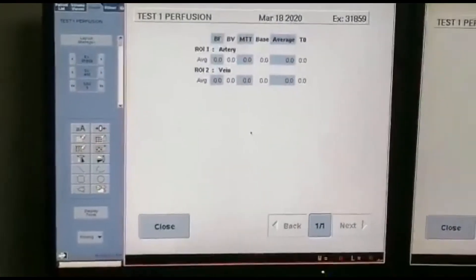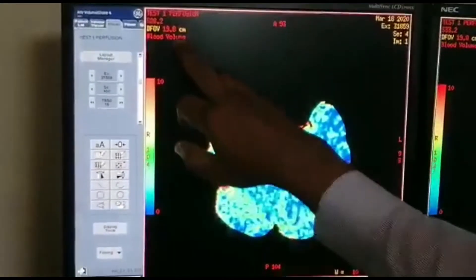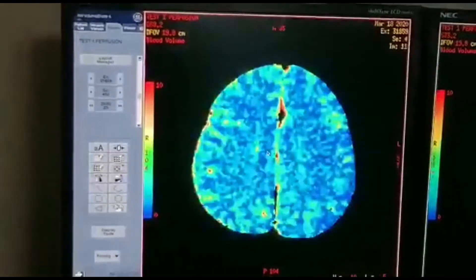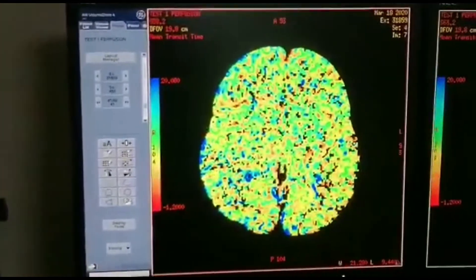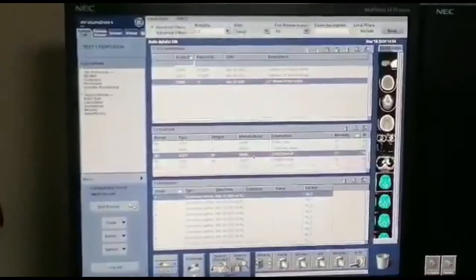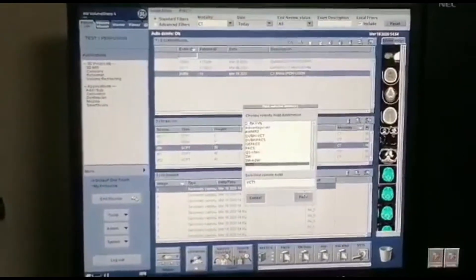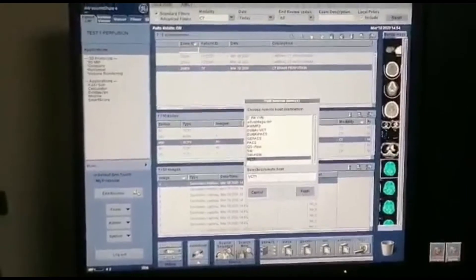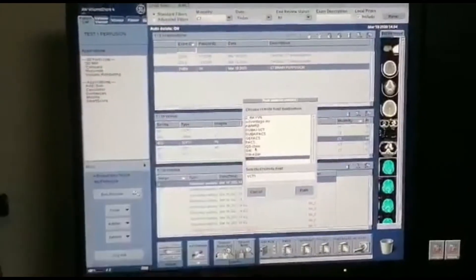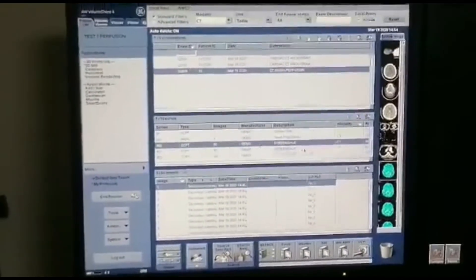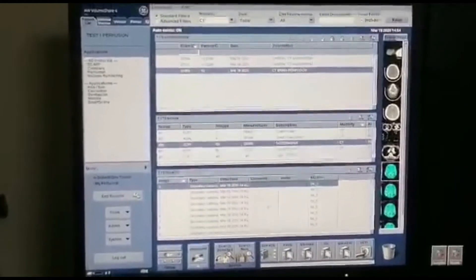So you get the flow, the volume, and the mean transit time. We need to send this sequence to the doctors, to the PACS, for review — screen save — and then push to PACS or wherever. We can send it to the CT and then send it to the PACS. That way the doctor can see.